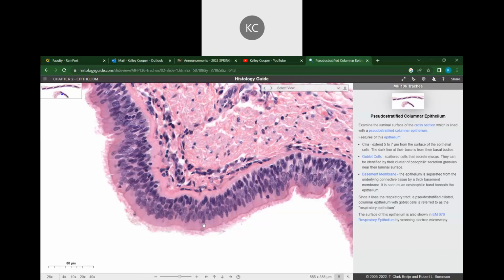So you have some nuclei that are very superiorly located in the tissue near the apical surface. You have other nuclei that are at the very bottom. You have ones that are in the middle. So you can see that all these purple nuclei are scattered all throughout the epithelial tissue. This is one key indicator to help you recognize this as pseudostratified columnar and not simple columnar.